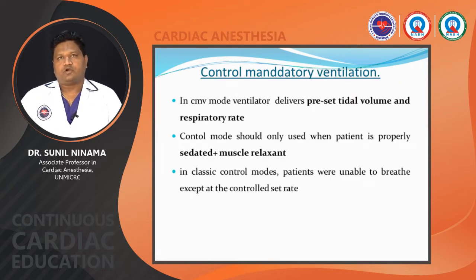What do you mean by controlled mandatory ventilation? This is called CMV. In CMV mode, the ventilator delivers a preset tidal volume and preset respiratory rate. So this is a totally controlled mode. You should only use it when the patient is properly sedated, and you have to give muscle relaxation to this patient.